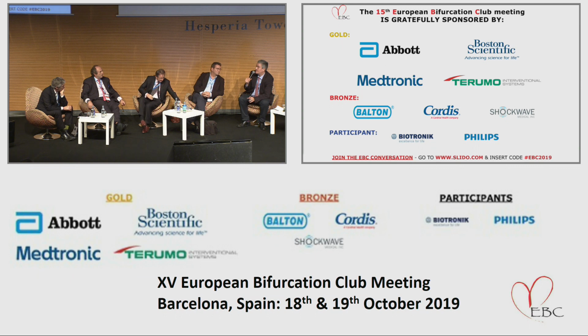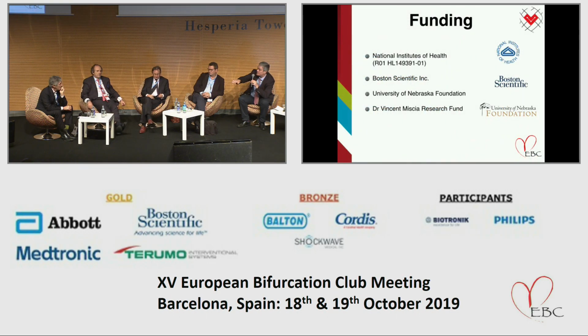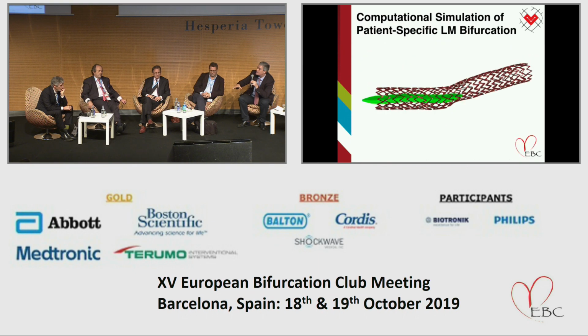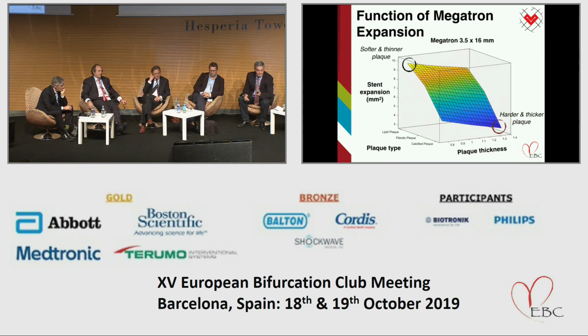Yanis, very short technical question. What kind of balloon was used for POT? What was the optimal position? Pressure, semi-compliant, non-compliant? Just a couple of words, because the projection towards the circ was mainly achieved by good position of the balloon. So you helped me here.